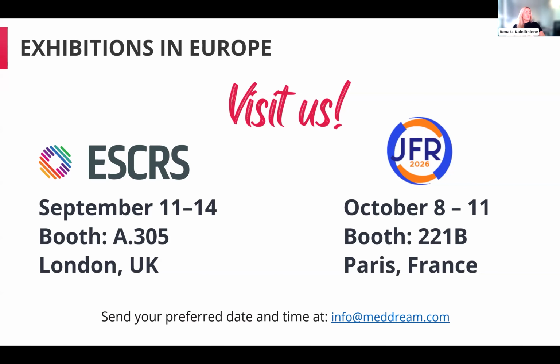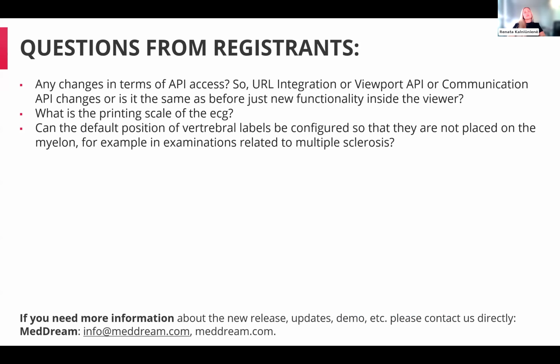Okay, another question came up also. Can the default position of vertebral labels be configured so that they are not placed on the myelon? Sorry if I pronounced it wrong. For example, in examinations related to multiple sclerosis.